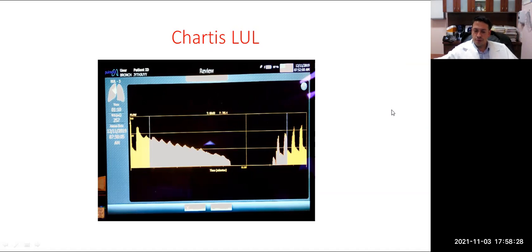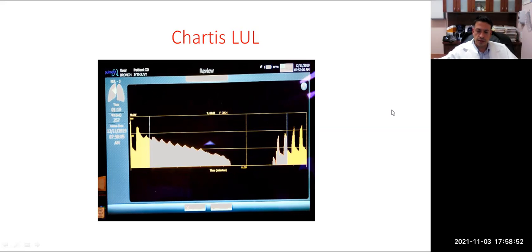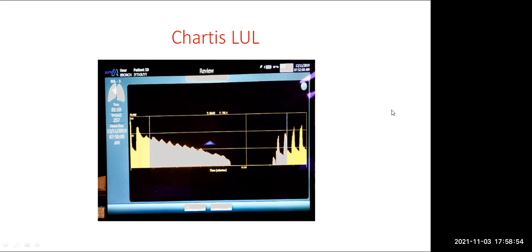And that's when the rubber meets the road, because you really need to go down to single digits. 6%, usually we say 6% is good enough. But you will usually get stuck at around 10% or 12% or 9%, and it'll just persistently stay there. It'll never go down to 0. And that is because of that small gap. I've seen that many times now.